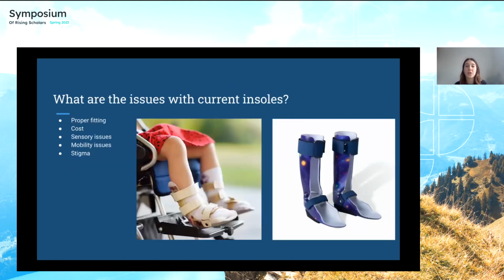So what are the issues with current insoles? There are several issues that children with cerebral palsy face, the first being proper fitting. Cerebral palsy insoles are custom to fit the individual's feet, which can be challenging with children who have rapidly growing feet, and frequent refitting may be necessary to ensure the insoles properly fit the child and provide the intended support.